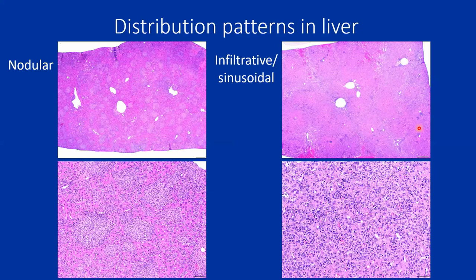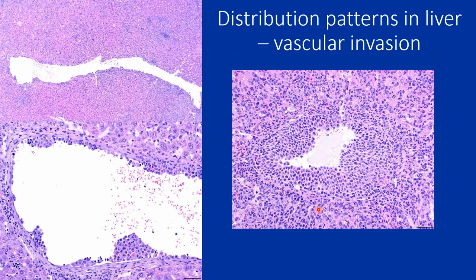Distribution patterns can vary. In the liver you can see it anywhere from really nodular discrete foci to really infiltrative, where you have to look closely to sort out what cells are in the sinusoids interspersed among hepatocytes. It's not uncommon in advanced cases to see vascular invasion. On low mag you can see the internal border of the blood vessel is irregular, with histiocytic sarcoma cells lining it and extending along it.